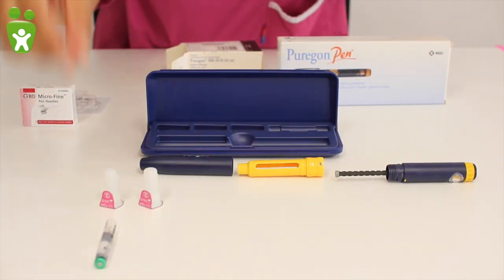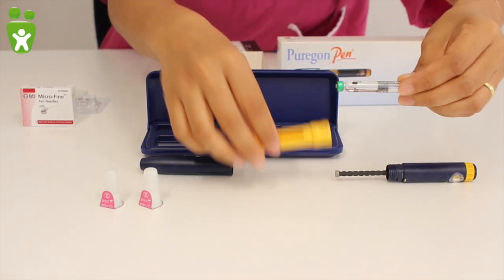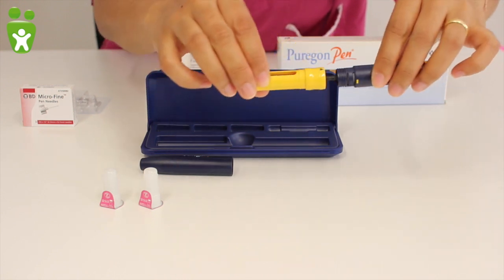Now I will show you how to insert the vial into the pen. The metal cap should point forward and is inserted into the yellow part. The pen is then screwed shut with the blue part.